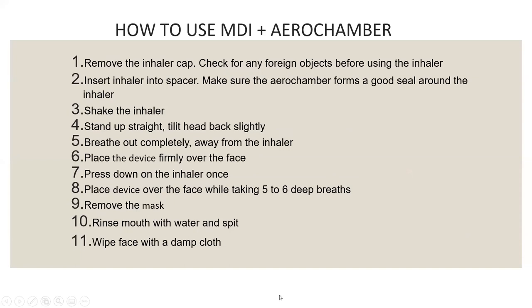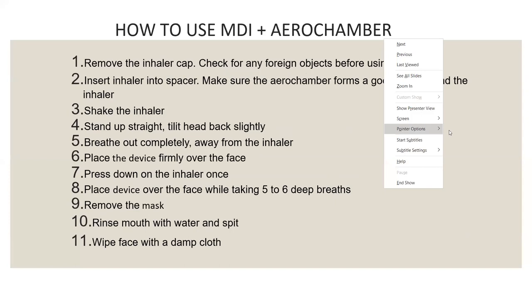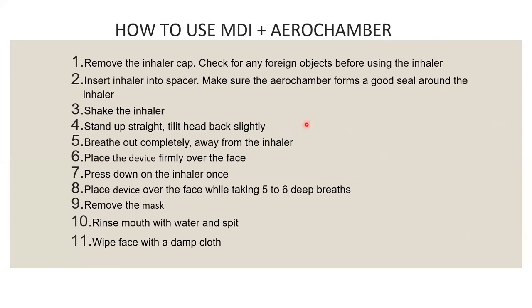So we have to know how to use the MDI in order to advise the patient how to use the MDI with aerochamber. For children, it is recommended to use an MDI with the spacer, as the child cannot coordinate the breathing with the inhalation. So how to use the MDI?